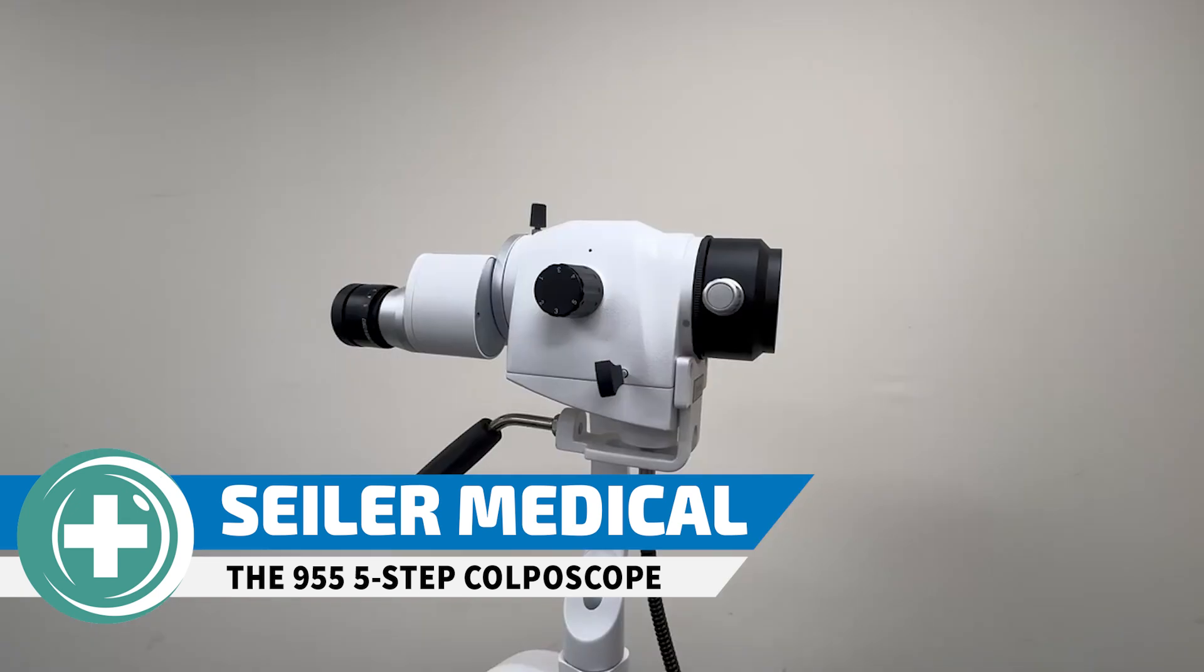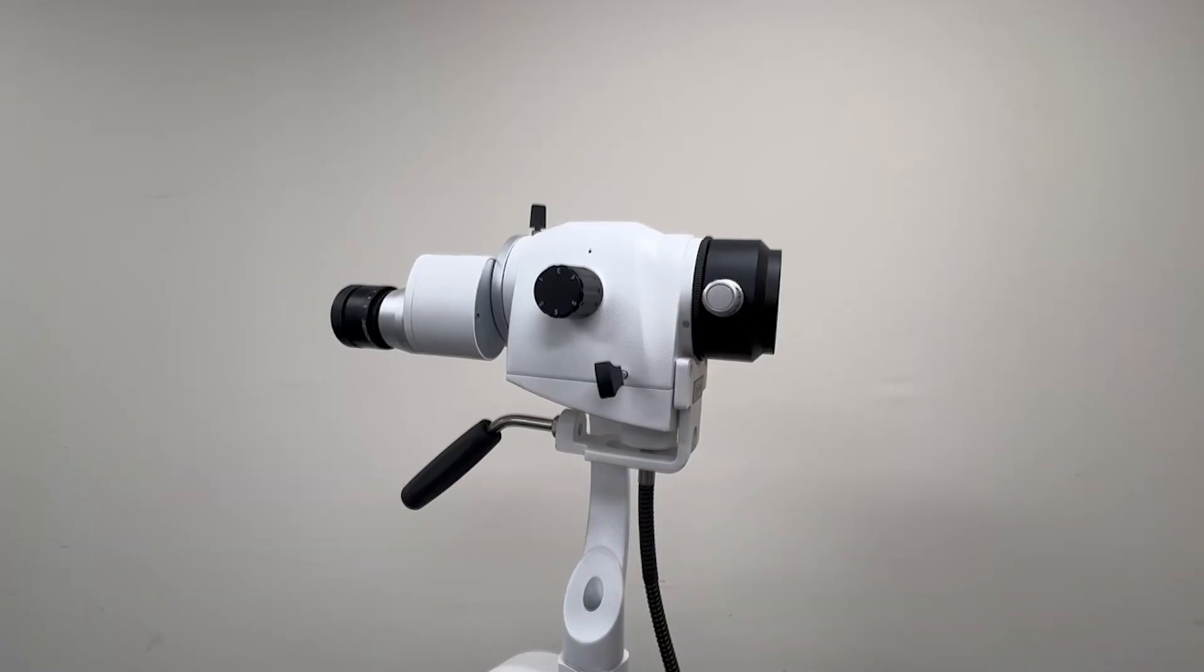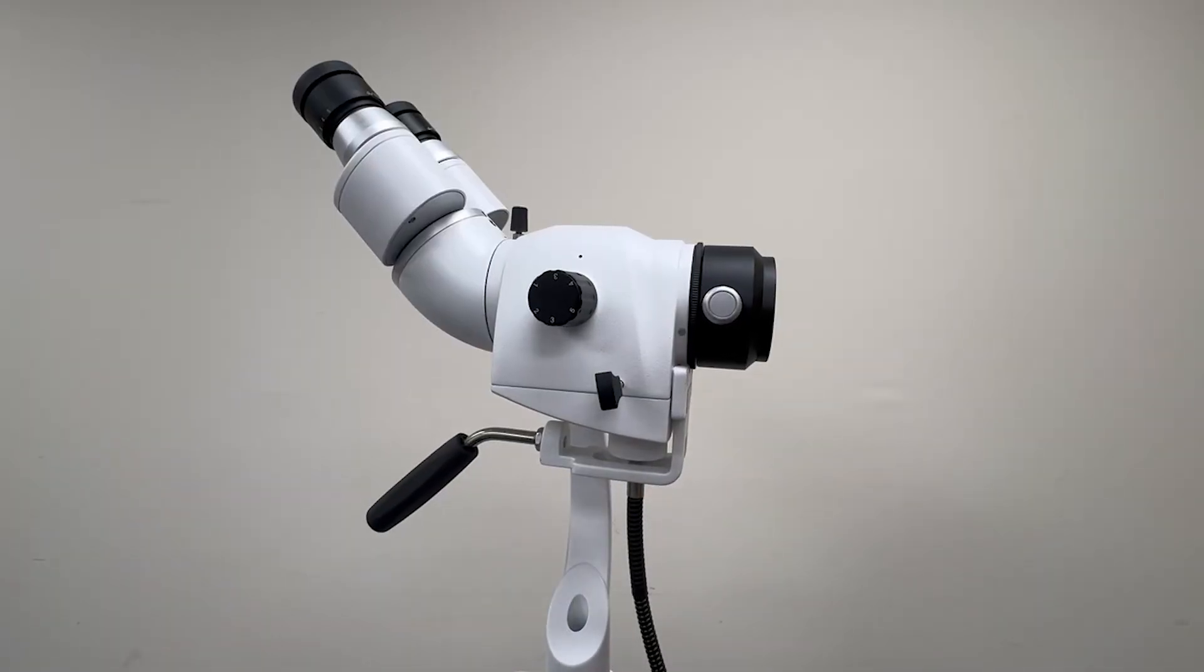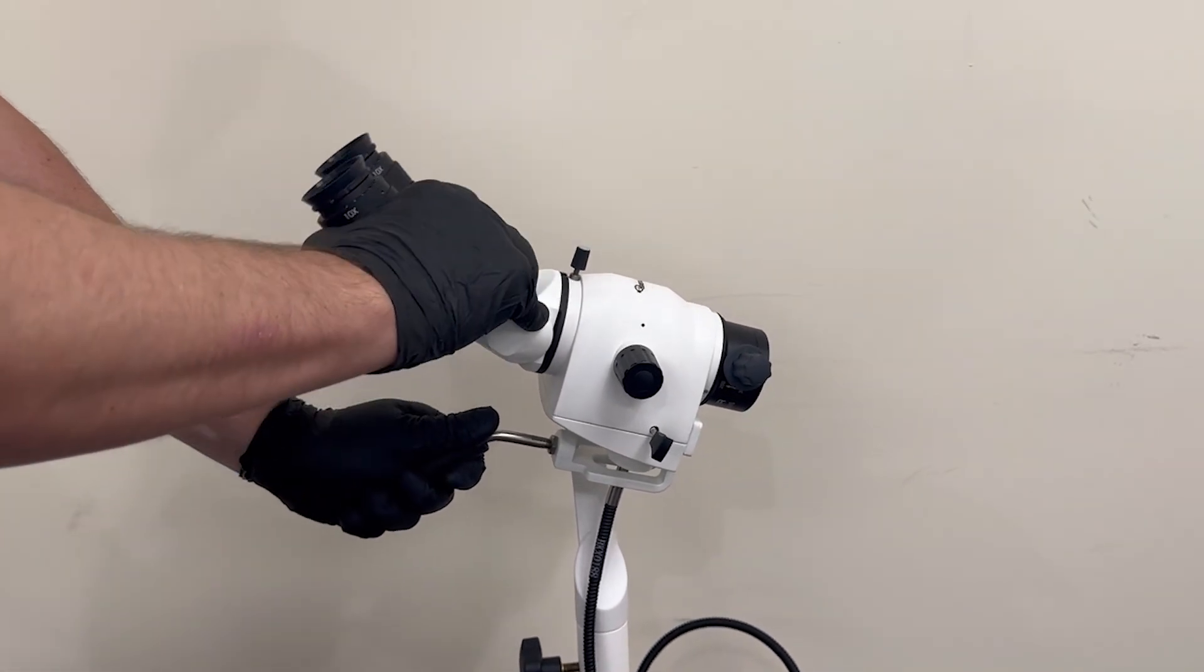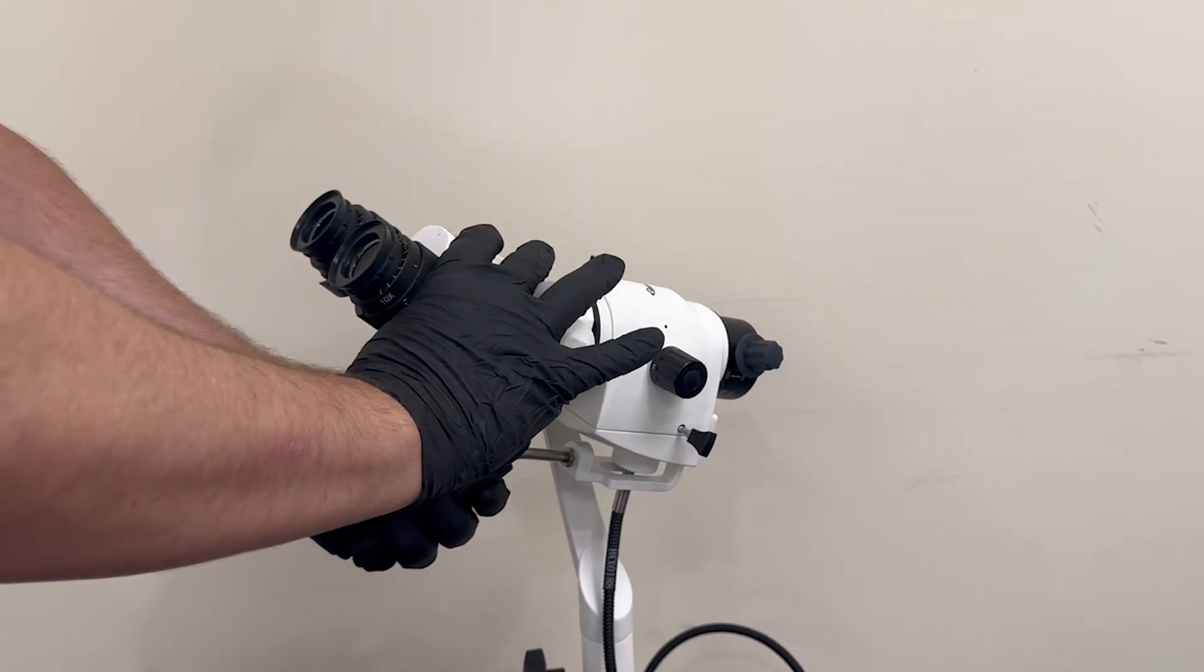The Seiler 955 Colposcope comes equipped with an optional straight, fixed 45-degree head or an adjustable head that ranges from 0 to 220 degrees, ensuring optimal viewing angles for the doctor.